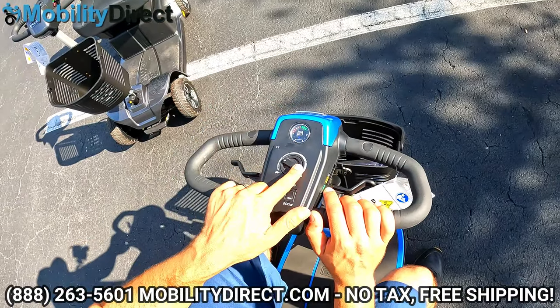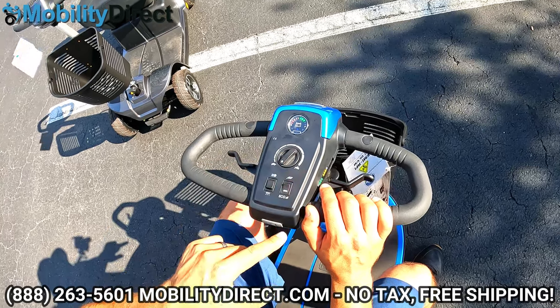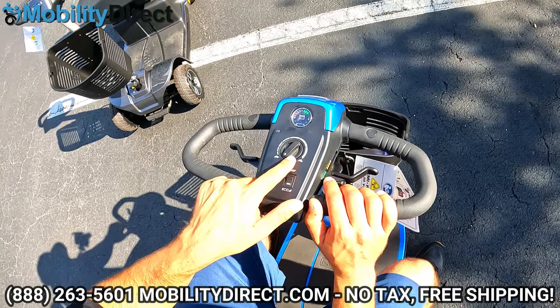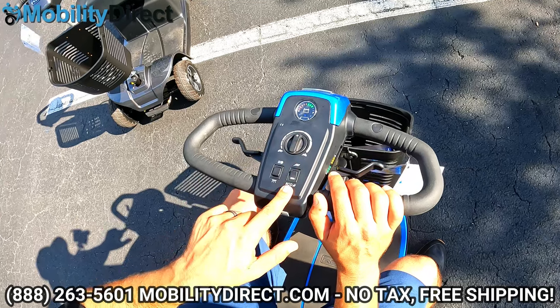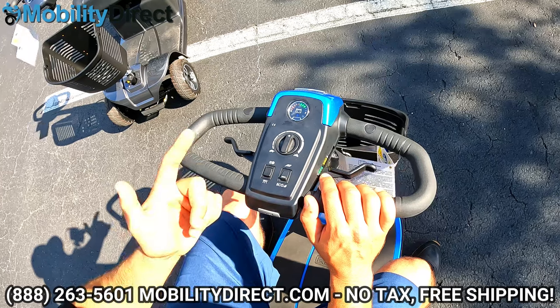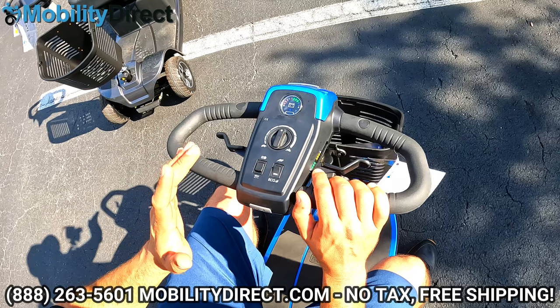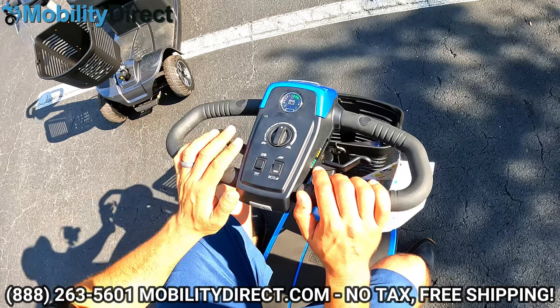You have a speed control limiting knob. If you want full speed, bring it all the way to the rabbit. If you want to slow down the top speed, bring it all the way to the tortoise. You have an eco mode and a full speed mode. With full speed mode, you'll go just over five miles per hour. Eco mode reduces speed about 50% and makes it a lot easier to control indoors.